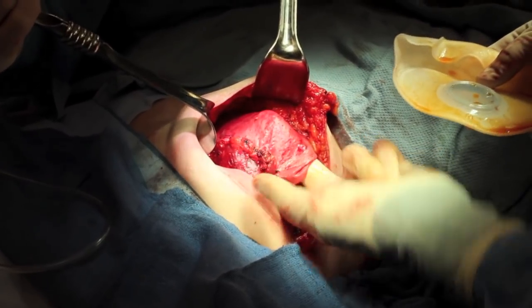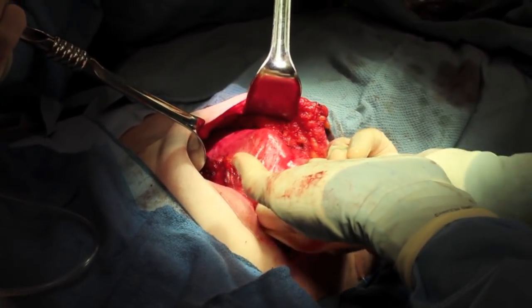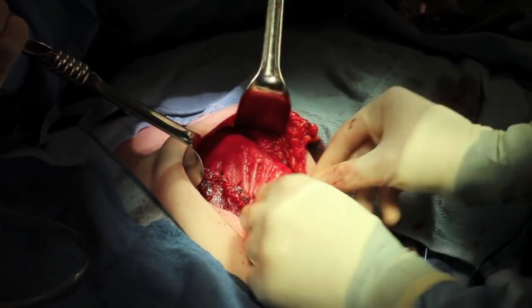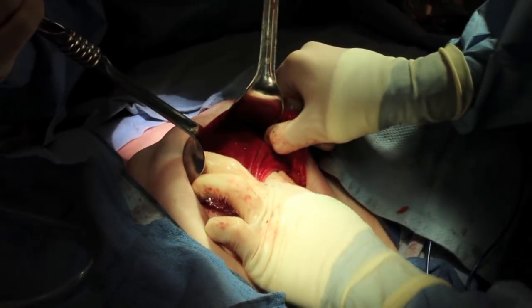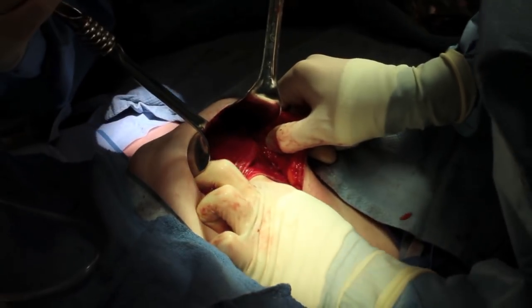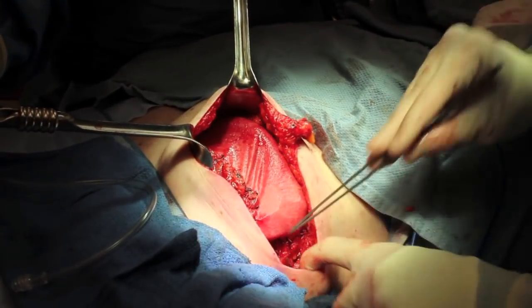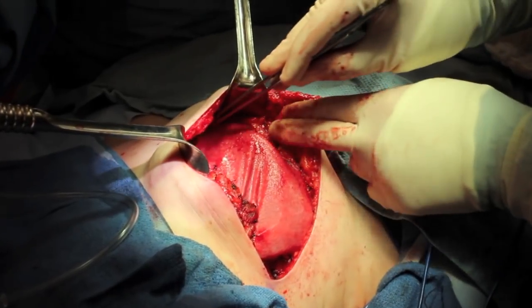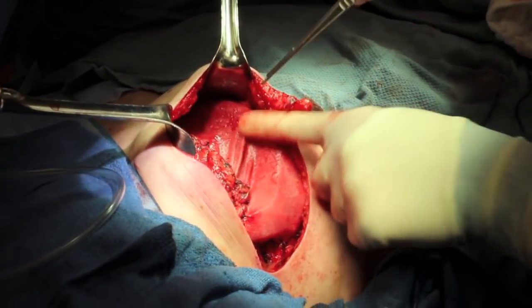Here the tissue expander is placed in the lateral part of the pocket and placed into position. And then the lateral part of the allograft sling is sutured down to the chest wall here. And you can see the nice inframammary fold that is formed. This has no saline in it.